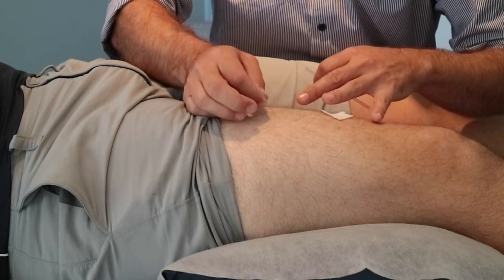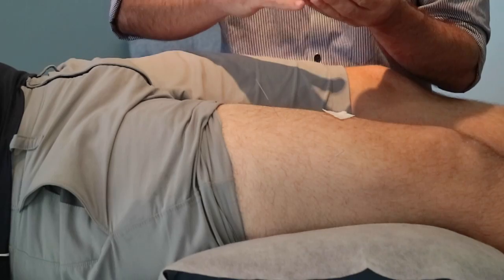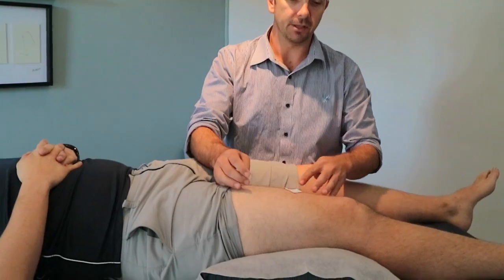It feels quite thick, and what you're looking for is a difference in tension of the muscle layers. So it'll be quite smooth, and then you'll actually hit something that's quite hard. It feels more like a feta cheese, less like bocconcini, more like feta. And when you start to hit parmesan, you're really getting into some crazy deep layers of fascia. So that's what we're looking at there. So that's the rec fem.